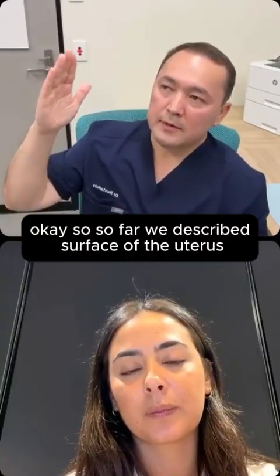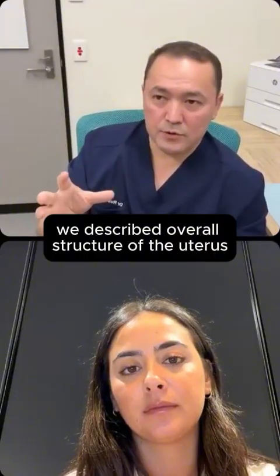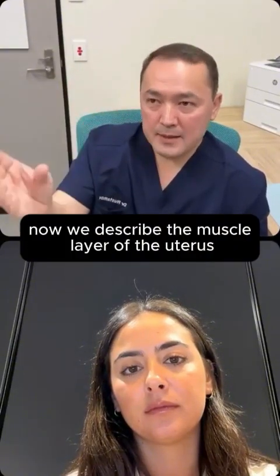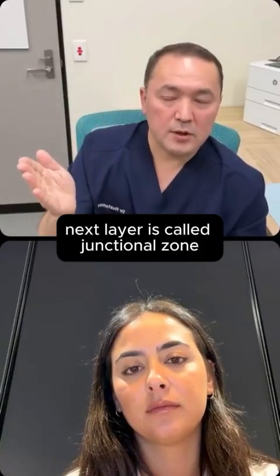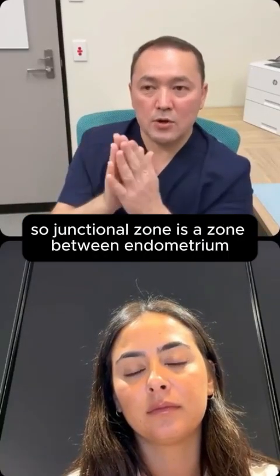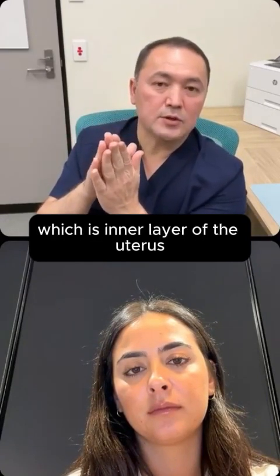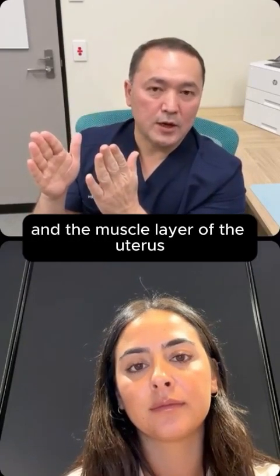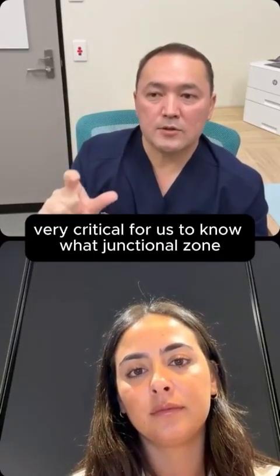Okay, so far we described the surface of the uterus, we described the overall structure of the uterus, and now we described the muscle layer of the uterus. The next layer is called the junctional zone. The junctional zone is a zone between the endometrium, which is the inner layer of the uterus, and the muscle layer. That's very, very critical for us to know what the junctional zone looks like.